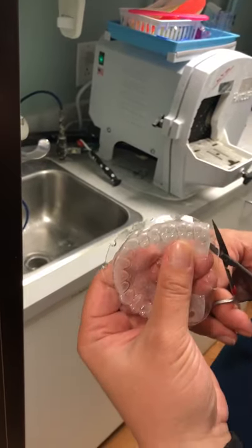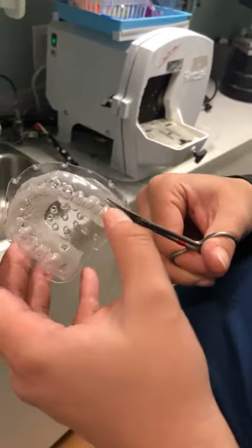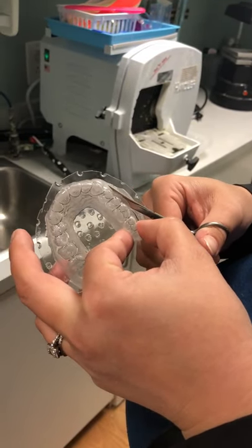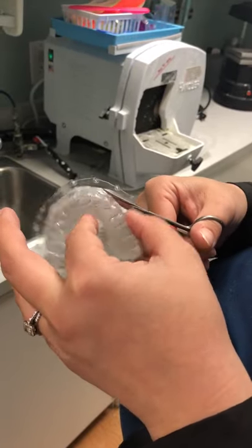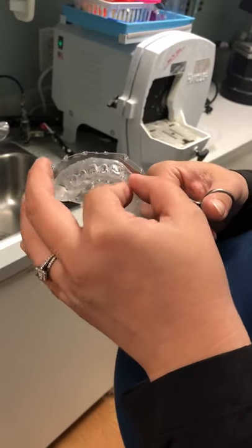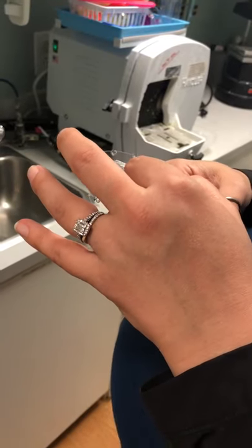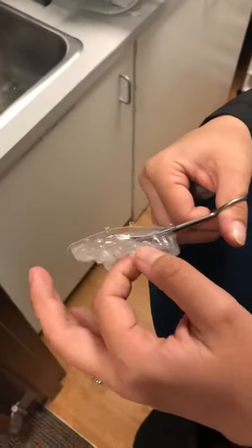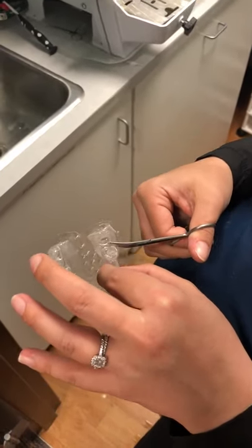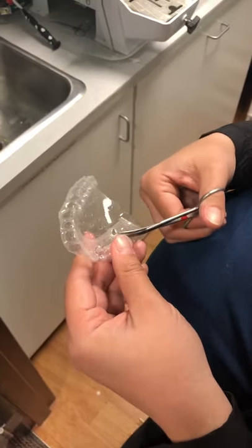Now in the video that we watched from Ultradent, they gave the option — they recommended scalloping along the teeth. We cut straight across about one to two millimeters above the gingival margin. This is personal preference, kind of like the blackout resin, which I do recommend — some assistants do not. It is a little bit more time-consuming, but I think it is effective. The reason I choose this is because it's also effective doing a straight cut versus a scallop.